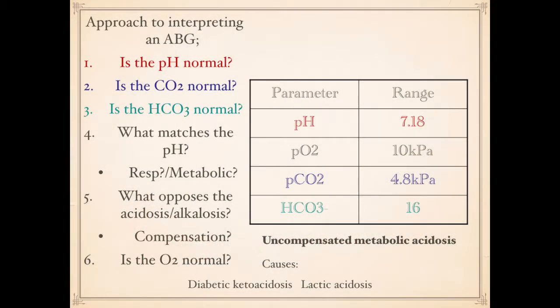Very well. Anyway, we're talking about the pathophysiology here. We're talking about hypoperfusion. If you can't get blood flow to your kidneys, i.e. AKI, you've probably not got good perfusion, so your lactate's probably going to be quite high. So yeah, I'm going to give you that mark. I'm quite happy with that. Those are the lactic acidosis referring to the sepsis.